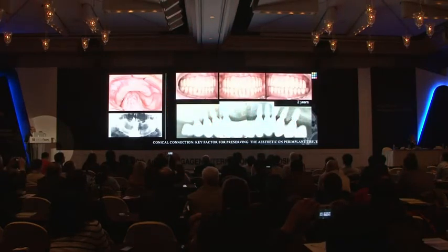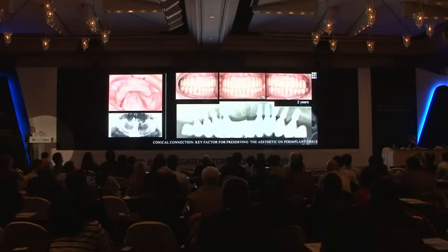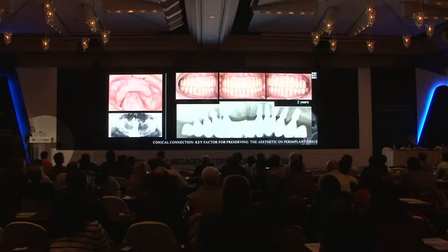And this is the clinical evaluation of the orthopedic prosthesis and the radiographic control after 2 years, where you can appreciate the perfectly maintained bone between the implants. Look at the bone peak between the implants.